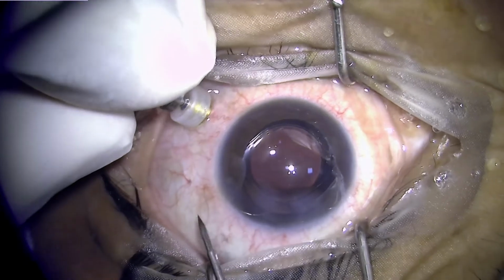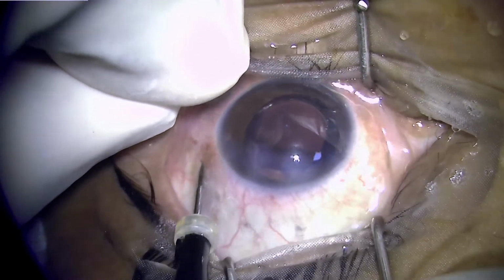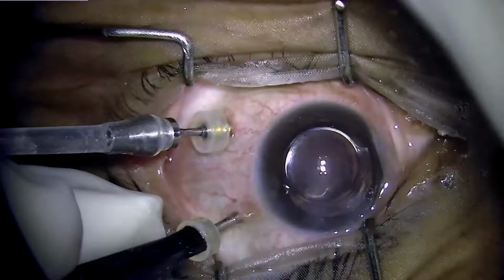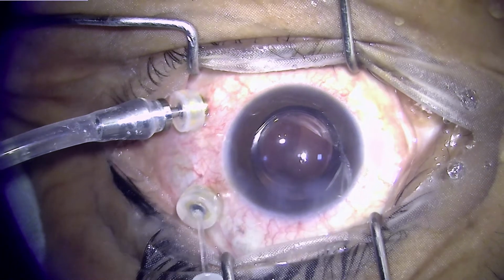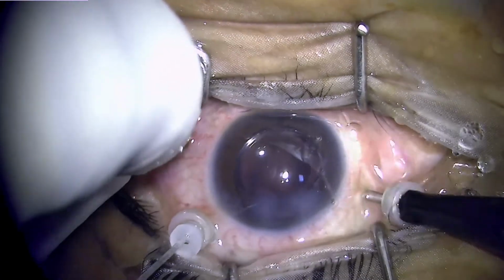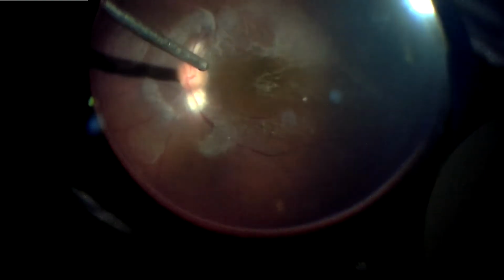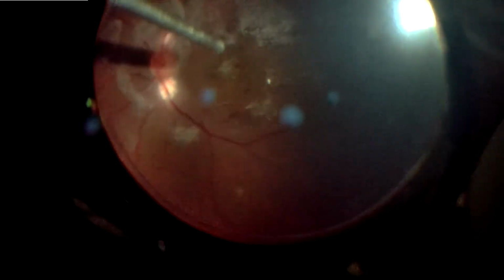So these are very small gauge trocar cannula. This is 23 gauge, which will leave behind a self-sealing wound which doesn't need to be sutured. And I usually prefer to use a chandelier which provides a nice wide illumination, and along with a wide angle viewing system, the view is excellent. The first thing to be created is the PVD, so that the retinal surface is devoid of any vitreous adhesions, and you can work directly on the retinal surface, which needs to be stained with vital dyes.